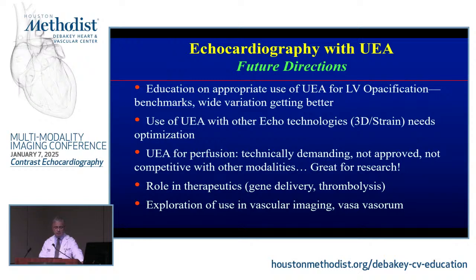So in conclusion, a few things. One, we spent quite a bit of time on appropriate use and also the technicality of it. This is very important. And I'm glad that I see that utilization is almost 7% in the country. And it has to be appropriate utilization, where you need it. And the impact is amazing from a clinical point of view.